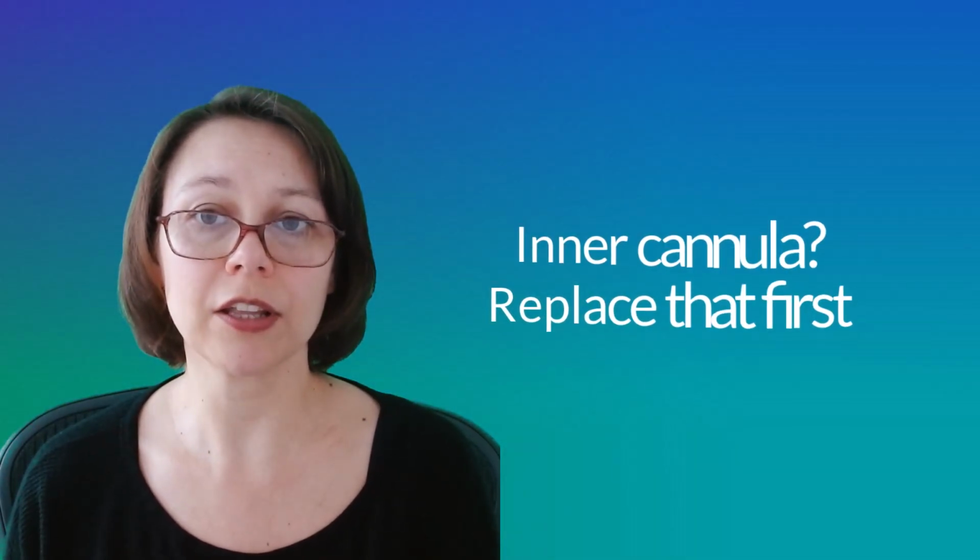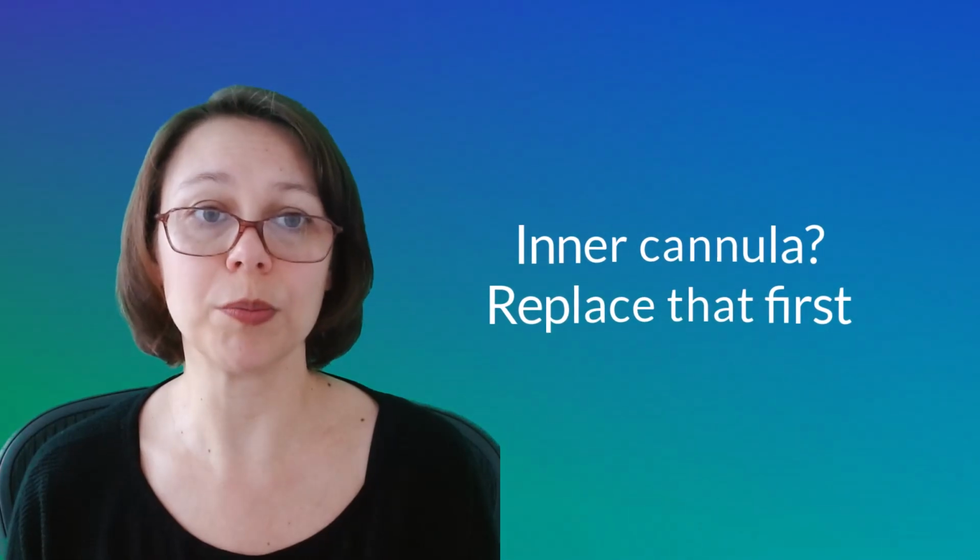You should assess the same way with a tracheostomy. However, a couple of things to consider here. First, if there is a disposable inner cannula, replace that rather than the tube itself.